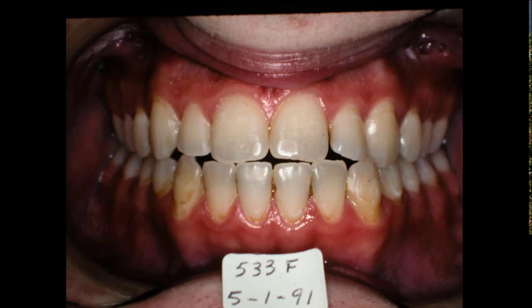Nice guy, though. You see the midline? You remember the midline was way over here to start with, and now it's kind of relapsed. It's moved over this way some. This was in a crossbite to start, and it's trying to get back in a crossbite again over here. Now, if I could have had him there at home where we could have watched him and stayed with him, I think we would have succeeded in keeping that in a good class 1 relation.